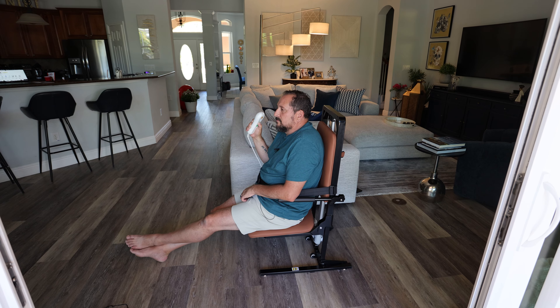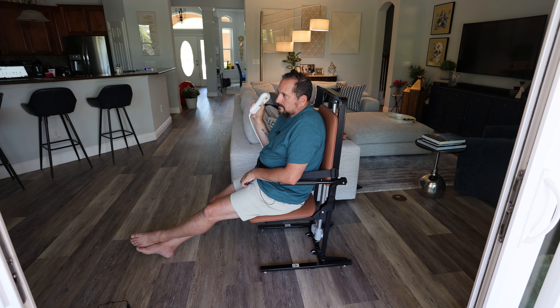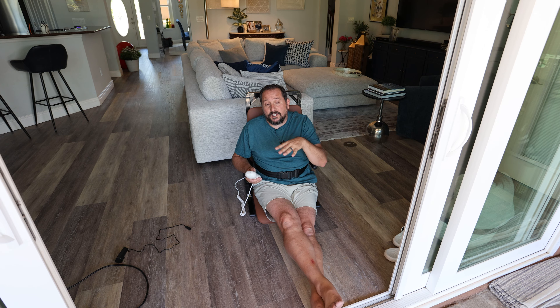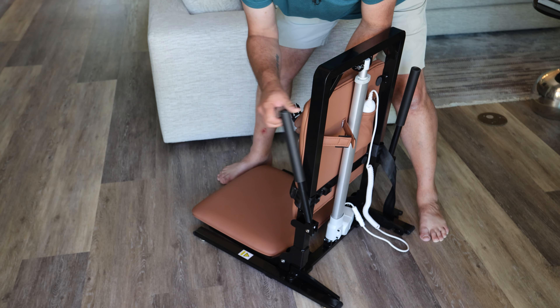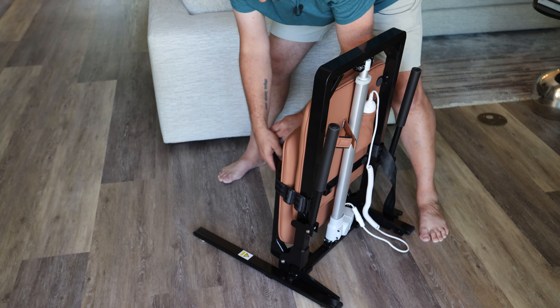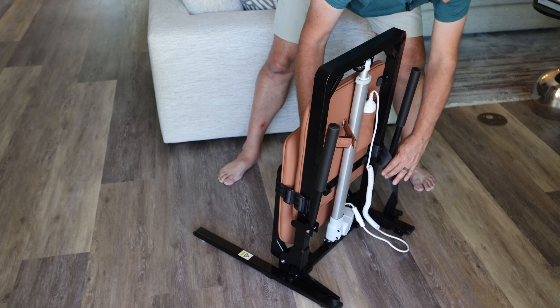It's going to absolutely change your life in terms of moving people around, and moving people around is really hard. This is going to make it much easier — you just press a button and they go up and down. To store it: put the arm up, seat up, tighten the seatbelt so it'll hold the seat up.